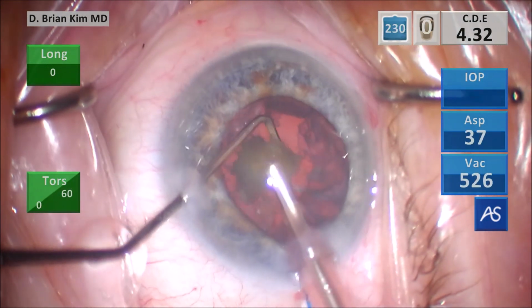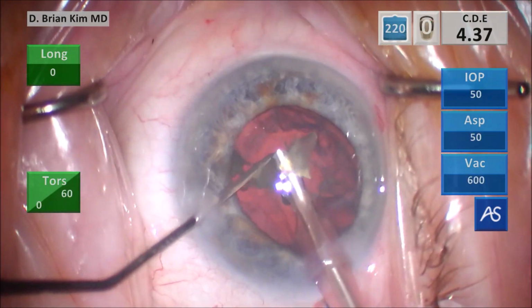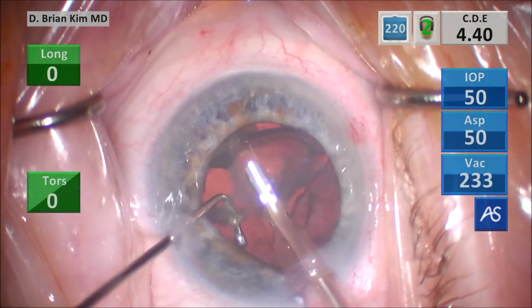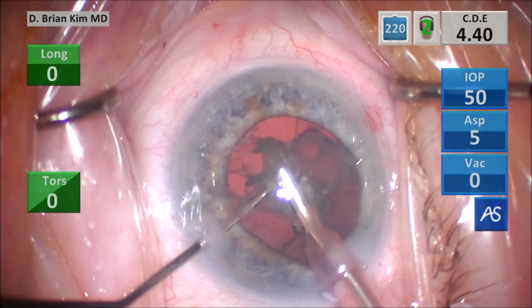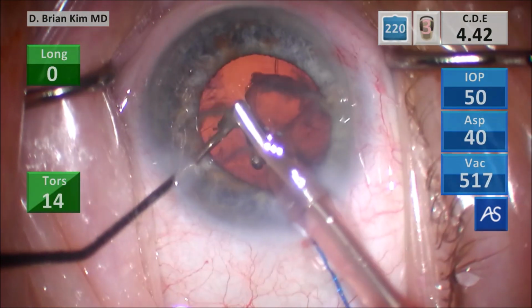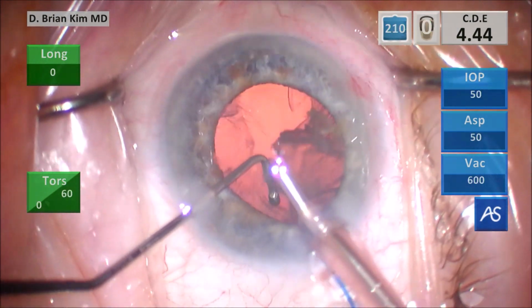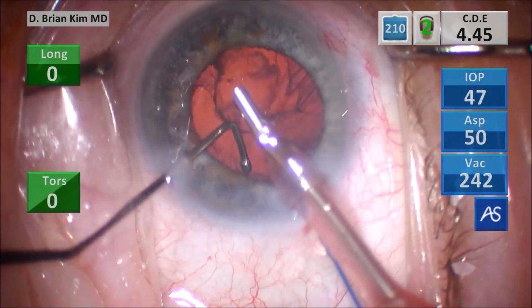Again, very different from anything I've ever learned when I was doing cataract surgery. And that's why I started doing this technique and published this technique. And once I've moved to this technique, I've really never looked back. To me, it's really the most safe way to do cataract surgery. I feel like my complication rate is much lower as a result. My rate of PC rupture and vitreous loss is much lower. I don't ever get corneal wound burns because of excessive ultrasonic energy at all, and I'm able to have clearer corneas after surgery.